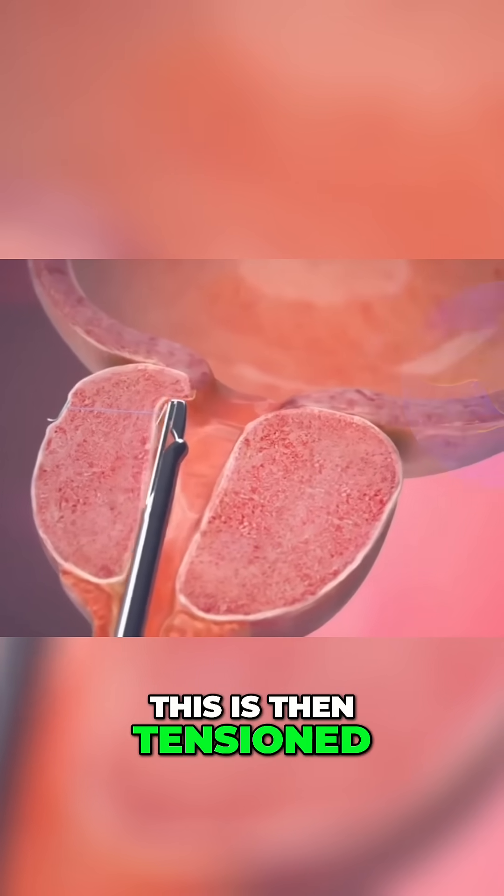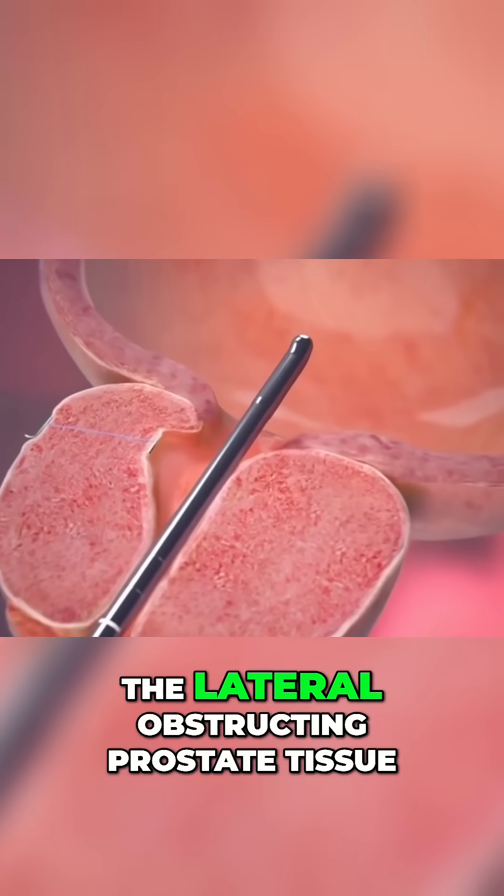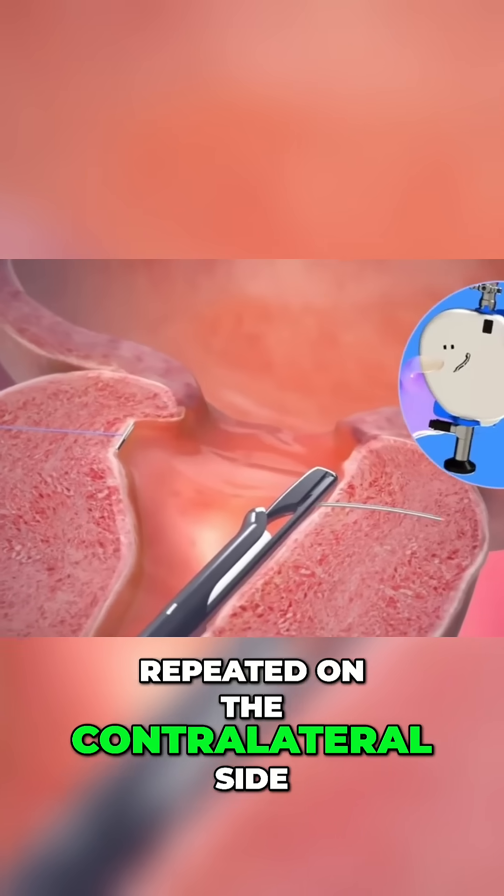This is then tensioned and a urethral anchor is deployed, allowing retraction of the lateral obstructing prostate tissue. The same process is then repeated on the contralateral side.